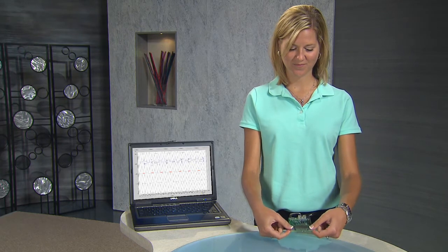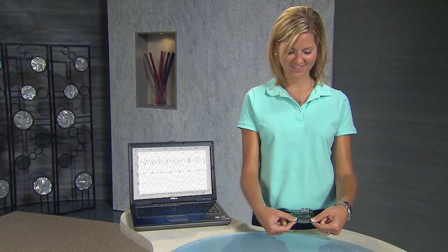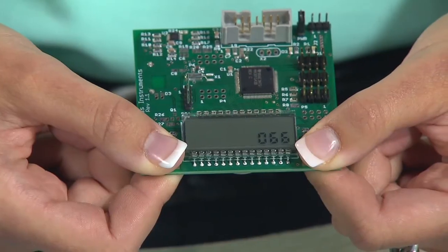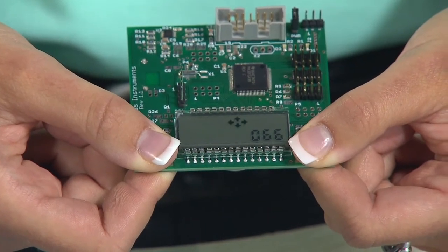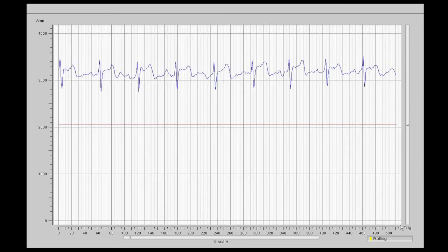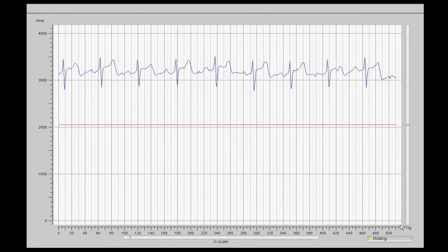The subject Randy will now place each thumb on an electrode. We wait a few seconds for the device to capture the heart rate information. The average human heart ranges between 50 to 100 beats per minute. As you can see, Randy's heartbeat is 66 beats per minute. The LCD displays the heart rate, while the EKG board can be hooked up to a PC via an RS-232 connection to display the heartbeat graphically.